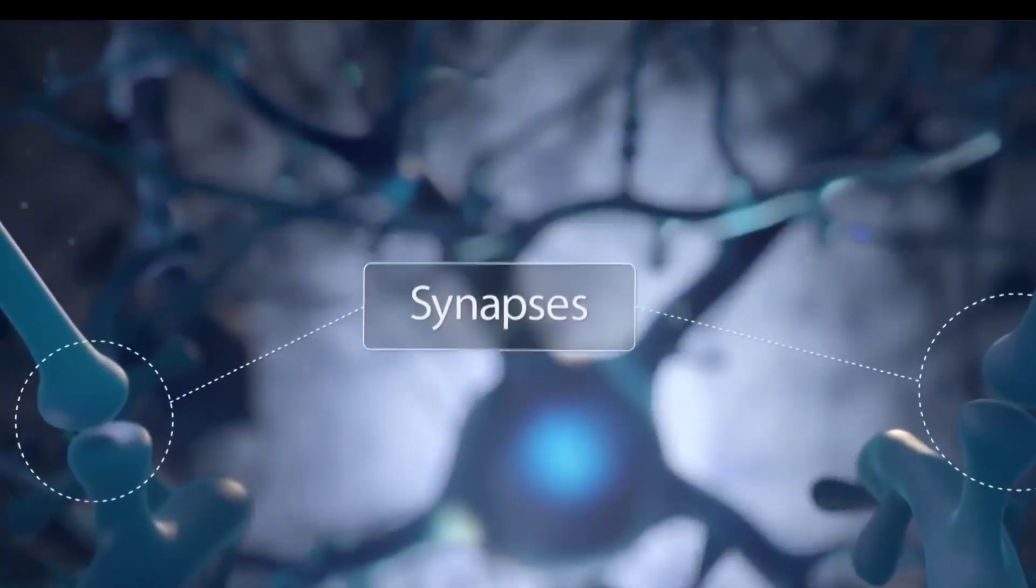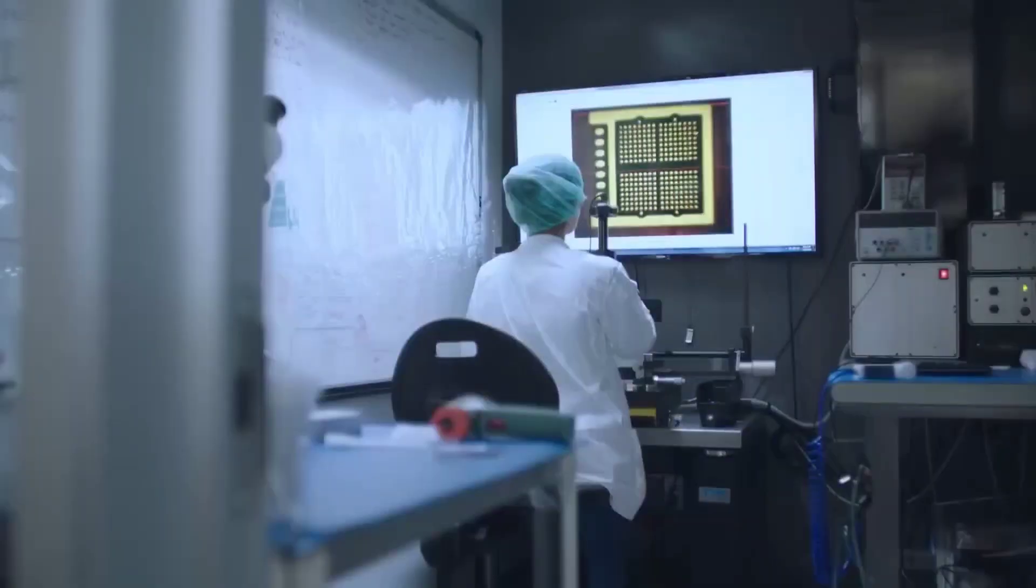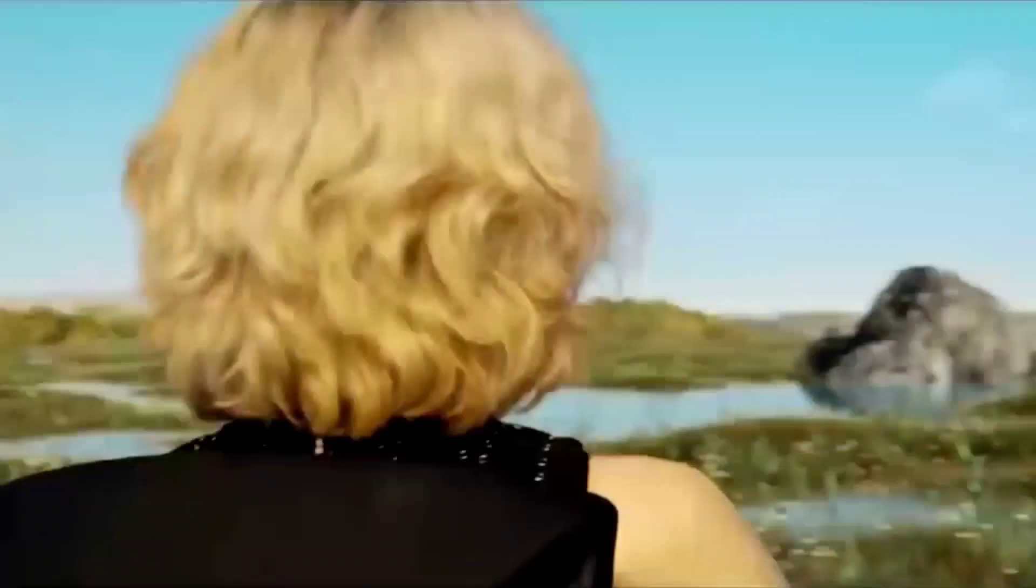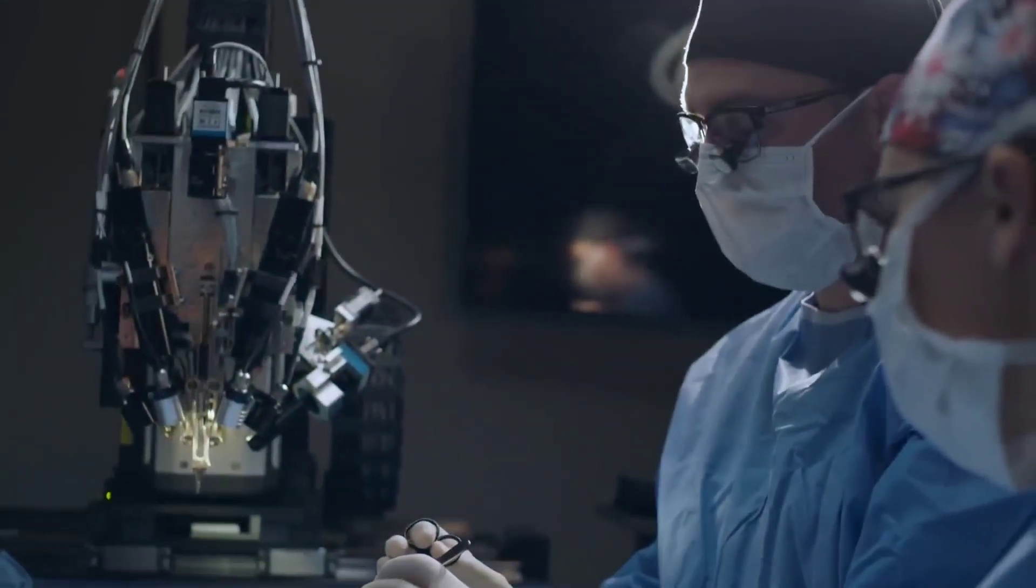Neuralink will implant four of these sensors, three in the motor cortex and one in the somatosensory cortex. It will communicate wirelessly with a device worn behind the ear that will serve as the sole source of data.